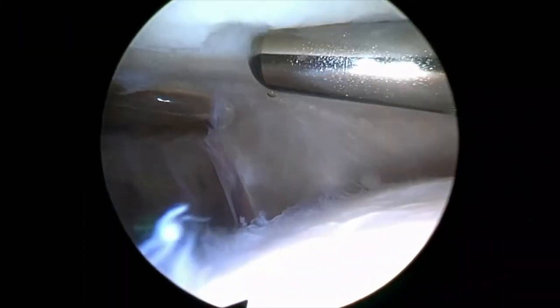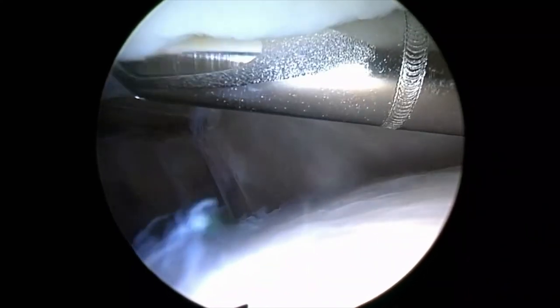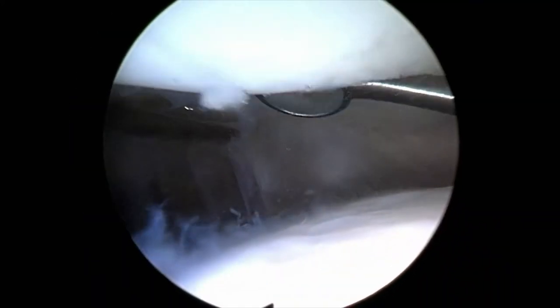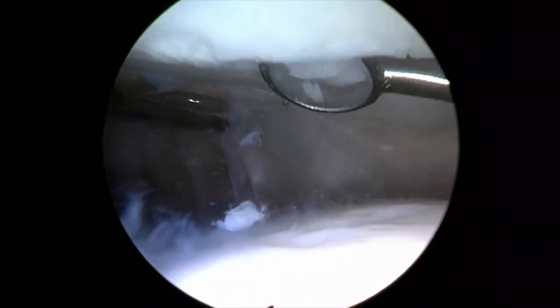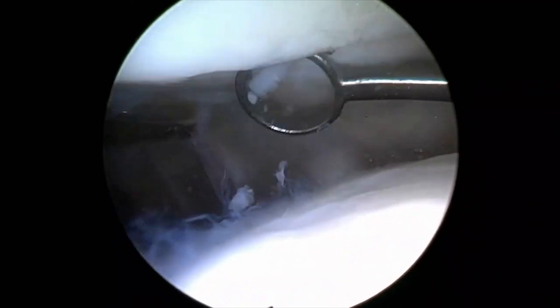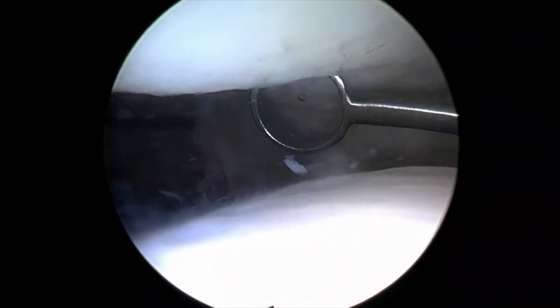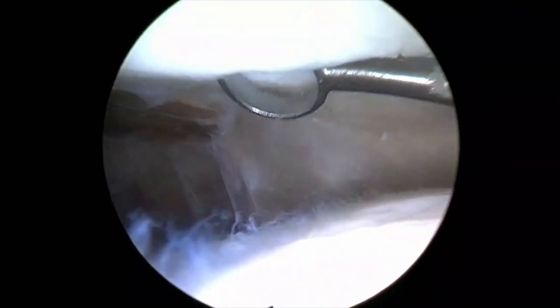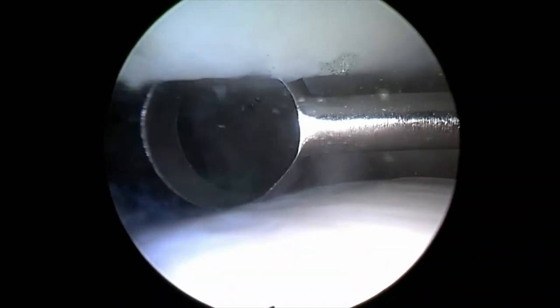Before the implantation, you have to perform a debridement down to the subchondral plate. You can easily use the shaver or a bone curette for this. If the cartilage defect has been present for a long time or if there is a pronounced bone marrow edema, you must be careful during preparation. If available, a curved bone curette should be used for the preparation of the patella — this makes the preparation more comfortable and precise, and you need to compromise less to create a stable cartilage shoulder.